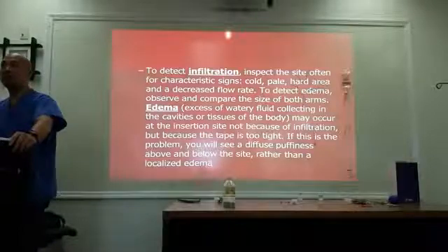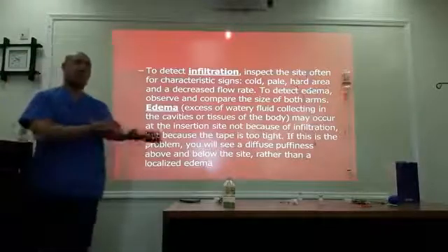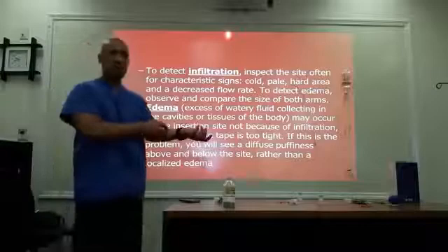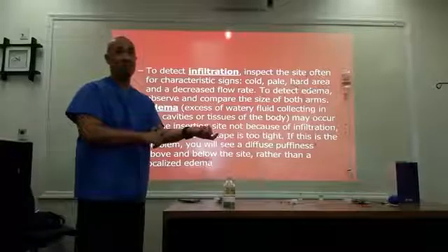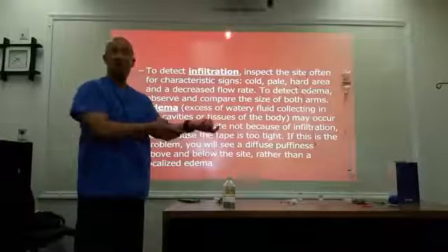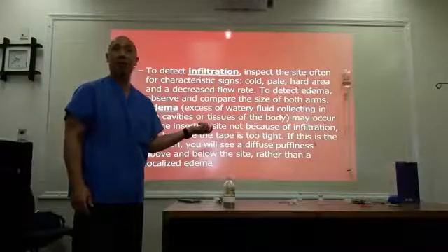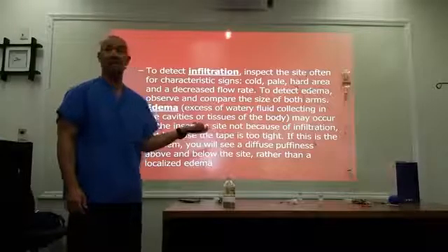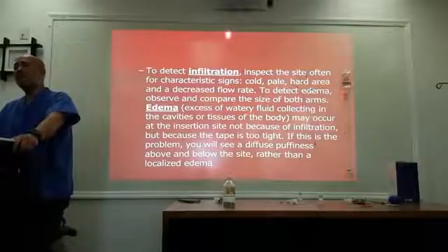To detect infiltration, again, you want to inspect the site often for signs of cold, pallor, hard area, and decreased flow rate. Because when you've got infiltration underneath around the injection site under the skin, it's very hard. It's also very painful, you know, and you're feeling for it, and it hurts. And if you hear the patient going, ow, ow, ow, is that not a good sign?